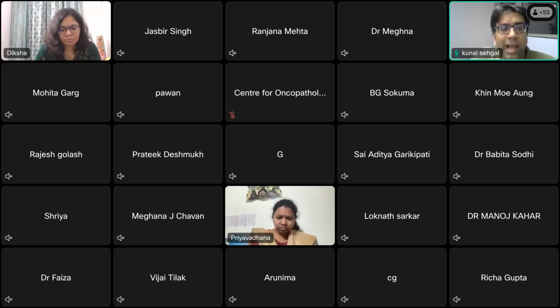As a lab director or consultant, I can set some rules. I can set a delta, or allowable difference, for hemoglobin. For one day, maximum 0.5 to 1; for ICU samples in hospitals it will be 1, and with some transfusion, more than 1 is challenging. For platelets I can put a cutoff of 20%, for example. Today the platelet count is 50,000, but yesterday it was 2 lakhs. Either there are clumps, or there's a sudden drastic fall in the same patient. So this kind of activity, the delta check being one example, and there could be other things.